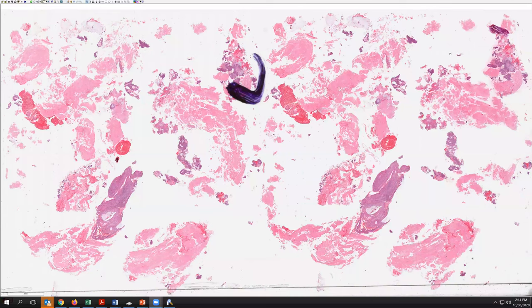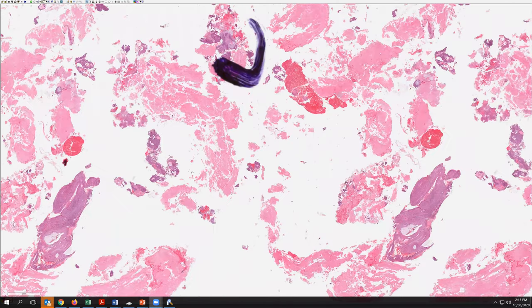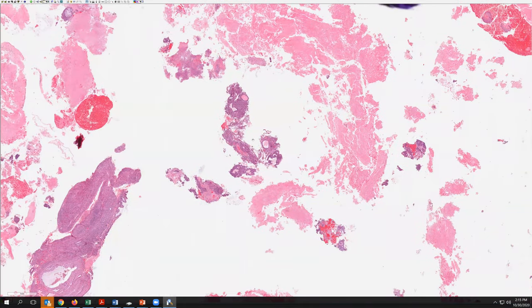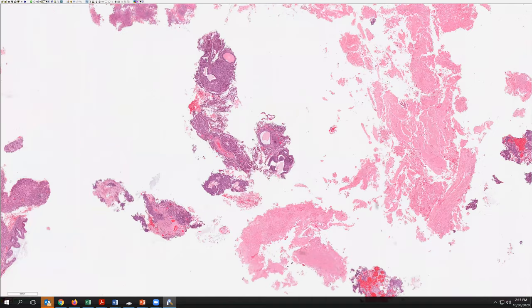Here at low magnification we can see what this curettage sample looked like and there are several elements here for concern. First of all at low power we see that there's a considerable amount of necrotic debris. All of this very pink material represents necrosis. We see there is some blue viable tissue that could represent a tumor and so we'll take a look at some of these areas as we go into higher magnification.